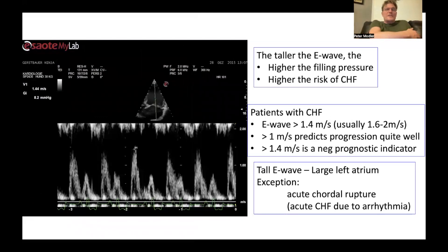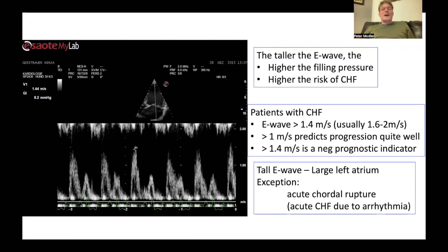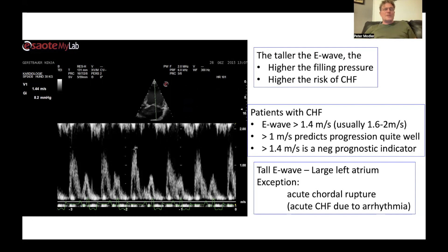In degenerative mitral valve disease, the taller the E wave, the higher the filling pressure of the left ventricle and the higher the risk of congestive heart failure. Patients in congestive heart failure usually have an E wave higher than 1.4 meters per second — in most cases 1.6 to 2 meters per second. An E wave taller than 1 meter per second predicts disease progression well, and exceeding 1.4 is a negative prognostic indicator for the development of congestive heart failure.